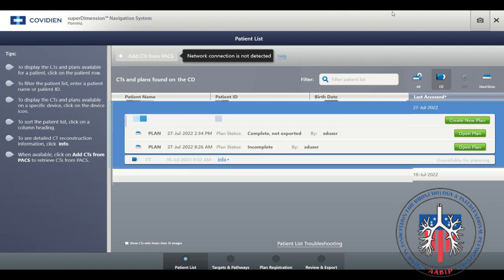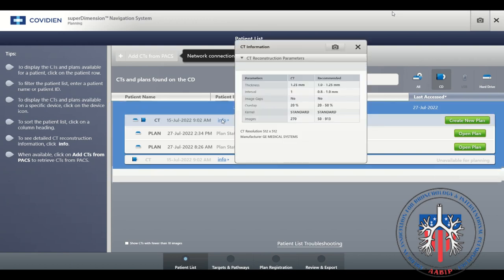To create a plan, first select the blue info hyperlink. A list of CT parameters will be displayed. Inspect the parameters to ensure they are within normal limits.